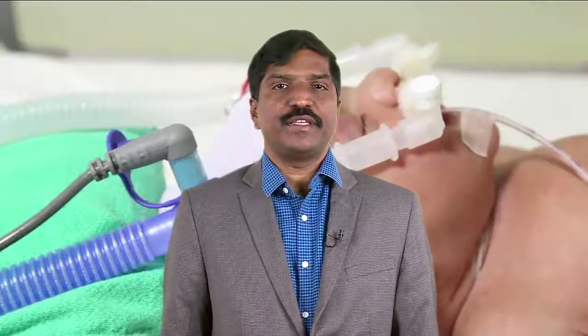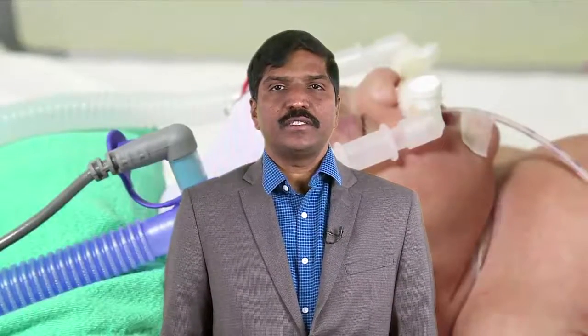The steps of CPAP application to a newborn would include connecting the newborn to a pulse oximeter, fixing the cap of right size, fixing appropriate type and size of nasal interface, checking the CPAP circuit for air leaks, and then connecting the CPAP circuit to the nasal interface. These two figures depict two newborns supported on CPAP, one with Hudson prongs and the other with Fisher and Paykel nasal prongs.